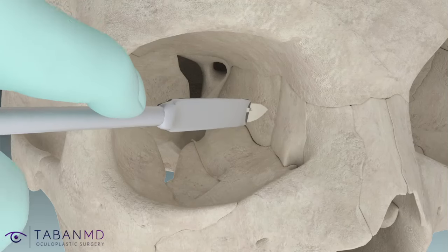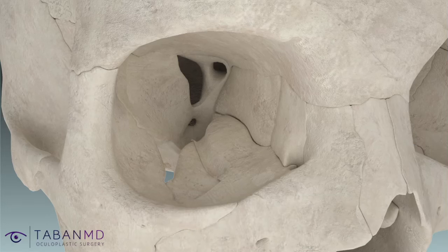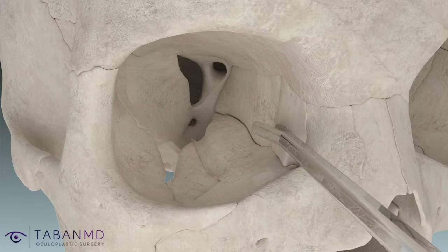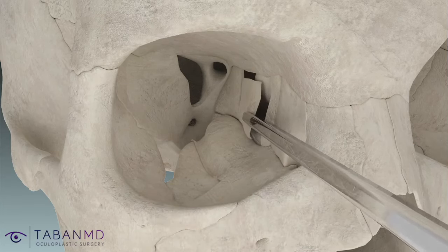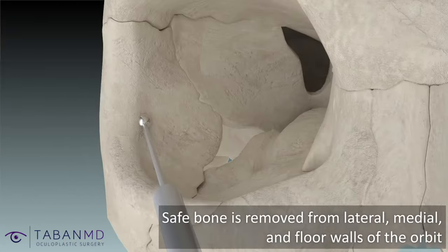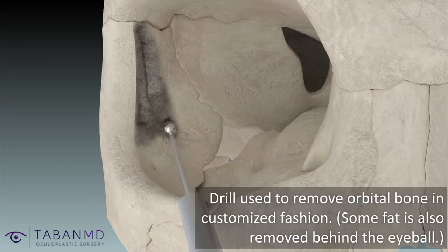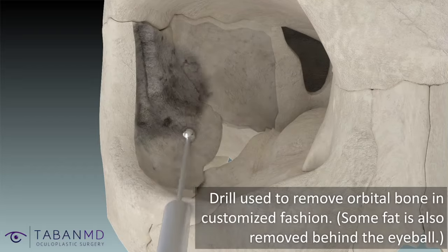The eye socket is approached through hidden eyelid crease and conjunctival incisions. Surgical tools and a drill are used to remove or thin out the bony medial and lateral orbital walls in a customized fashion. Some of the orbital floor and fat behind the eyeball can also be removed.